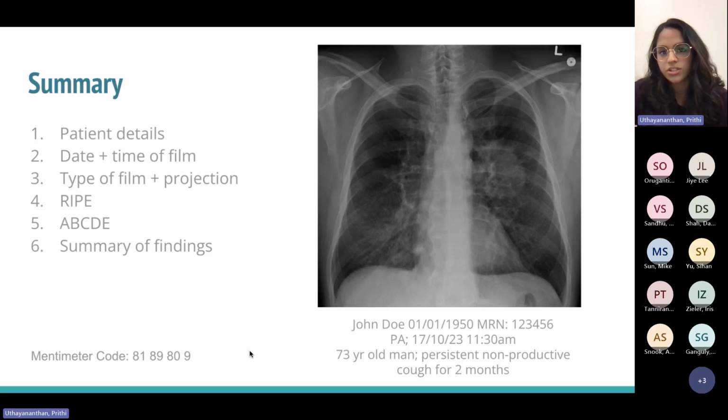So going on to the airway, the trachea appears to be central and not deviated. The carina is visible and unremarkable. We can see the hilar, and the right seems to be normal, but on the left there is a mass obscuring this region. So moving on to breathing, there's lung markings present throughout, as we can see, white wispy bits throughout. But there is, again, a large single irregular rounded mass in the left parahilar region. And other than that, you can't see the pleura, so it's unremarkable.